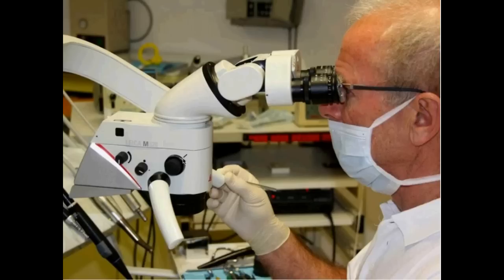A question also regarding Zeiss and Xenon. Do you have a comparison from the Leica and the Zeiss, also with the light, LED versus Xenon? Well, I still have a microscope with a xenon light, and it's not quite as good as this LED light. And of course, the bulb has to be changed sometimes, and it's also a question of price, which is between 600 and 800 euros for a xenon bulb in the one I have.